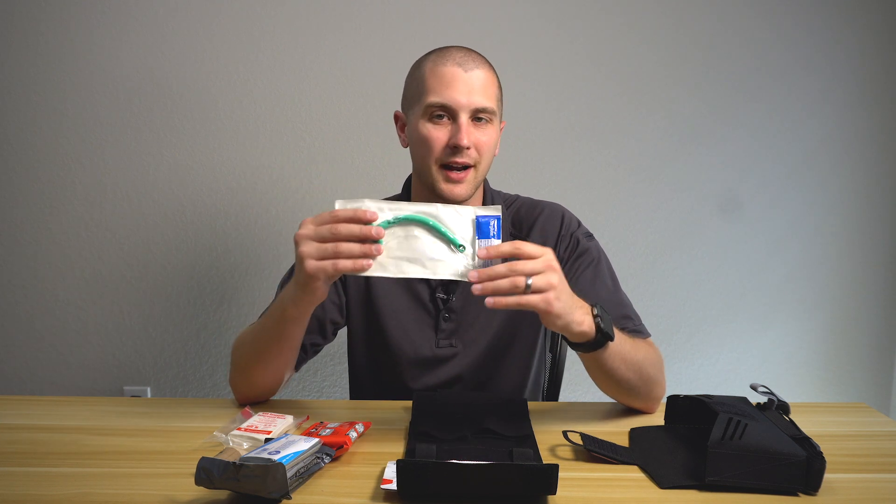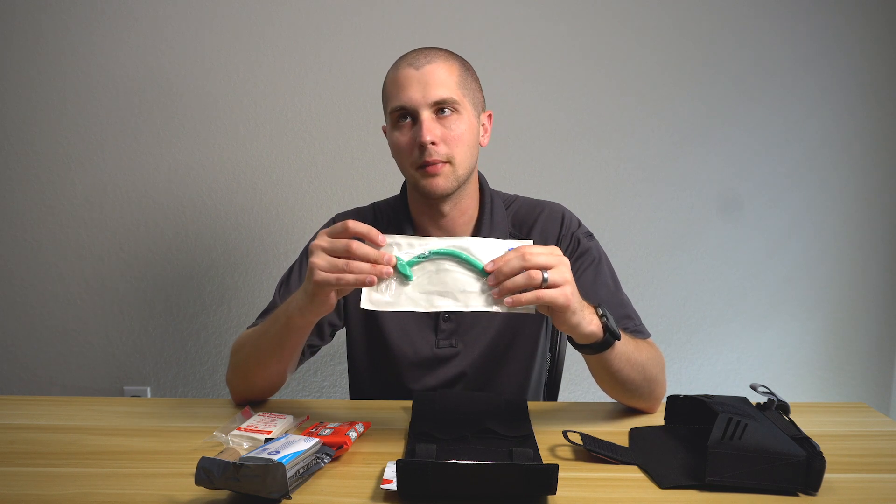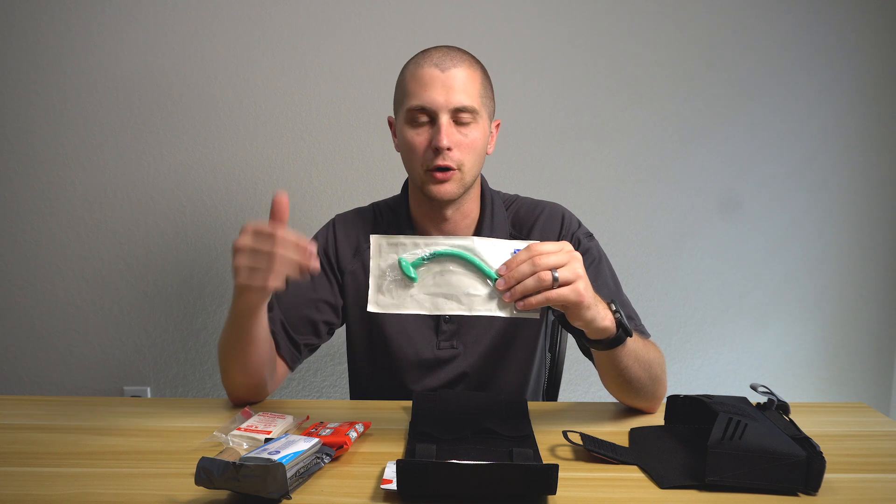For isolated head trauma, I would not hesitate to put an NPA in. You can see more about these in my airway management video that I did almost a year ago on the channel.